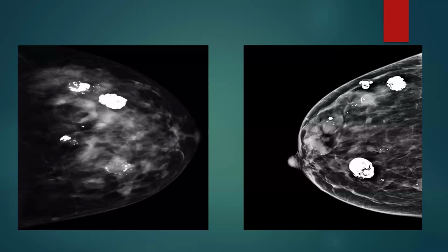There are several masses of different sizes seen on these images. Some of them show calcification, mostly in the entire mass, representing involuting fibroadenomas.